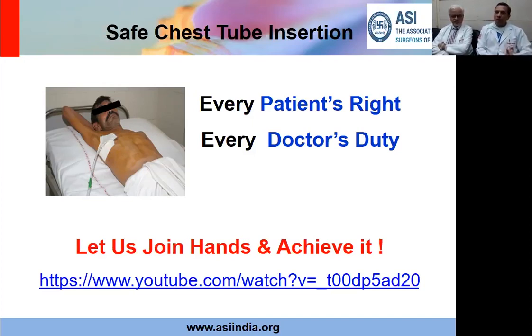Now, if you have a blocked chest tube, the first thing I want to tell everyone is there is no role of flushing of the chest tube. Please, friends, be very clear. Sometimes I have seen people taking a 20 cc syringe, filling up with saline and pushing the saline. I've seen people taking an aseptic syringe and connecting it and flushing. You will introduce infection from outside.